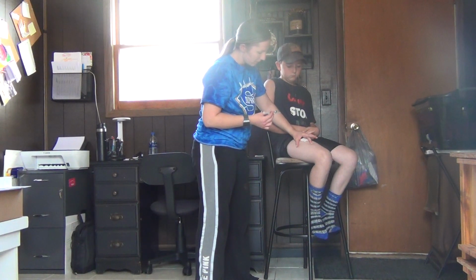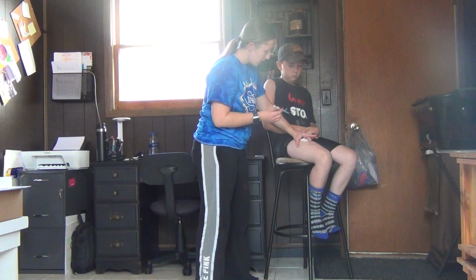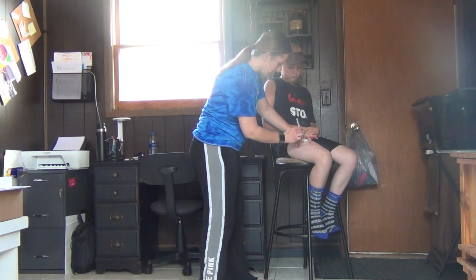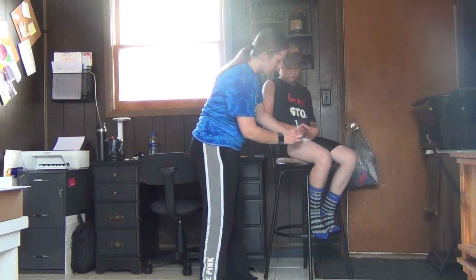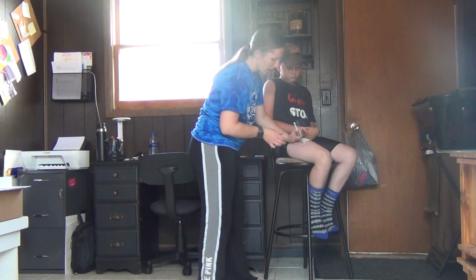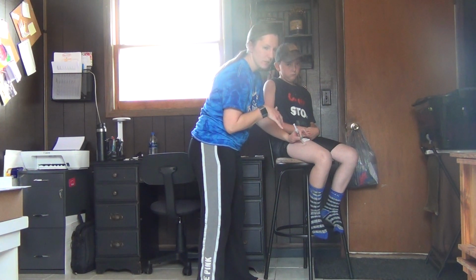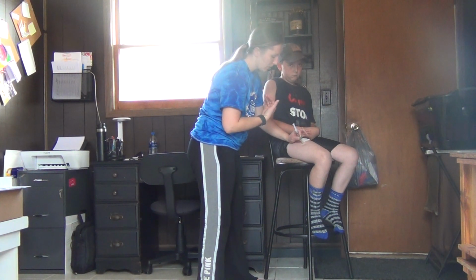I would pull the skin nice and tight. I would tell the patient that there's going to be a prick, so then I would push the needle in. Typically the needle would be down, so it would be a little bit easier, but I would stabilize with my non-dominant hand. Then I would pull back, I would aspirate, and I would wait about 5 to 10 seconds to make sure that there was no blood that came with that.